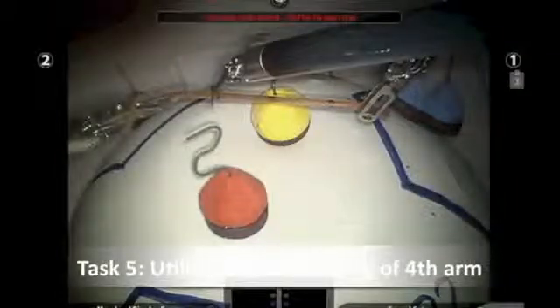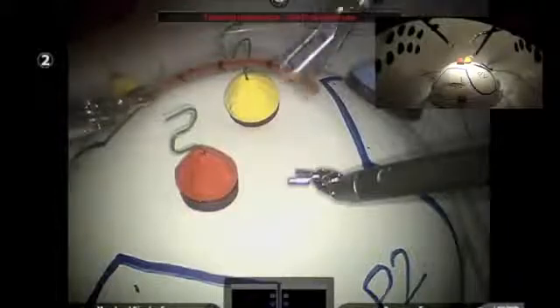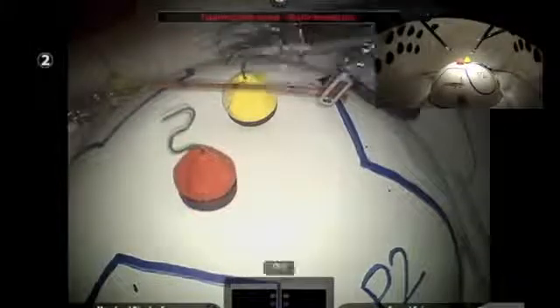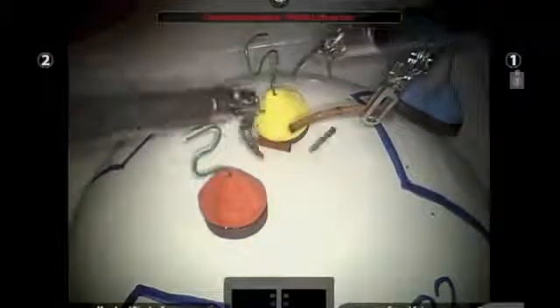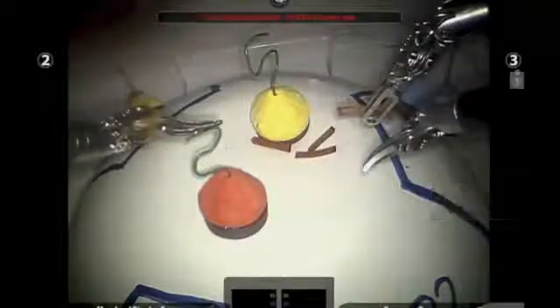Task number 5 is utilization and switching of arm 4. The learner is to pick up the simulated vein with one arm and the other arm to provide retraction. Then the learner is to switch from the 4th arm to the monopolar scissors in order to cut the vein at the hash marks. This exercise evaluates use of multiple arms and use of the monopolar scissors.